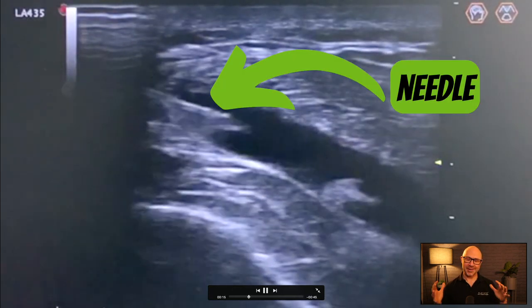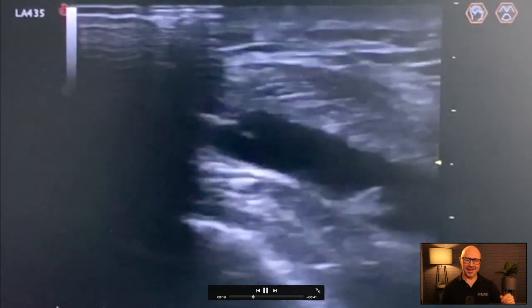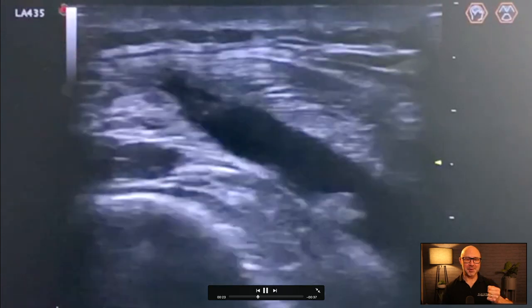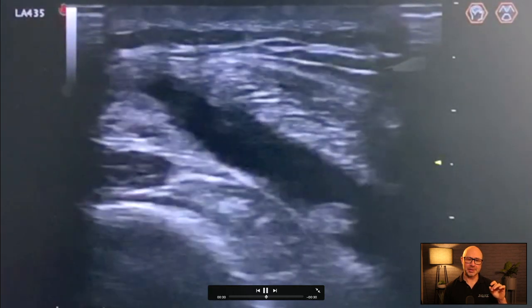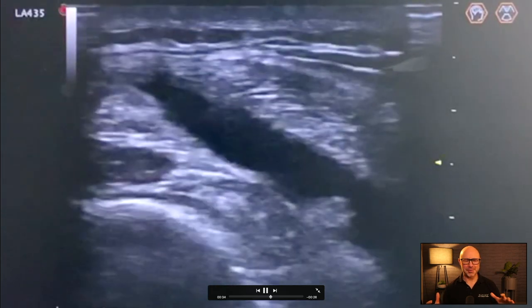It was really awkward, actually. I had the phone on a tripod thankfully, because I was trying to scan my leg and bring the needle at the same time — I don't have three arms and my feet aren't that dexterous. You can see me moving and wiggling the needle just to make it easier to visualize. I do lose it — it's not my greatest bit of work, to be honest, but it was awkward doing this on yourself.